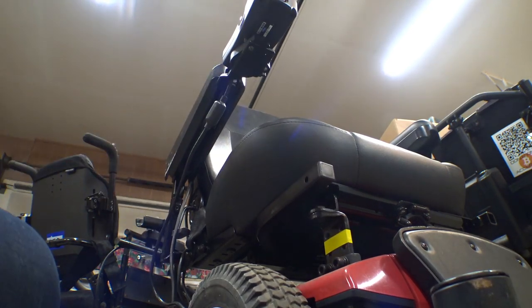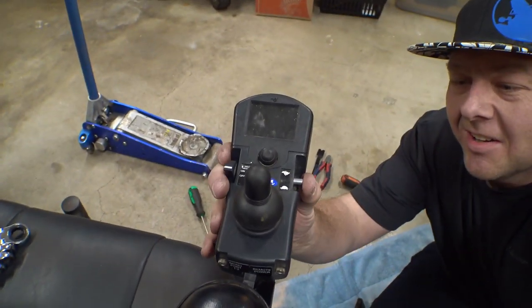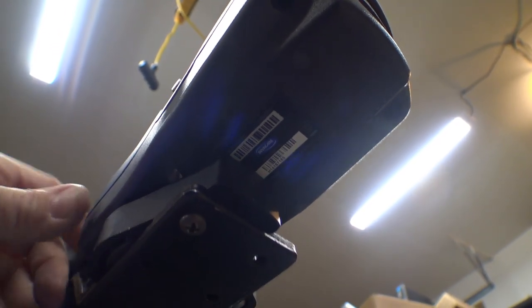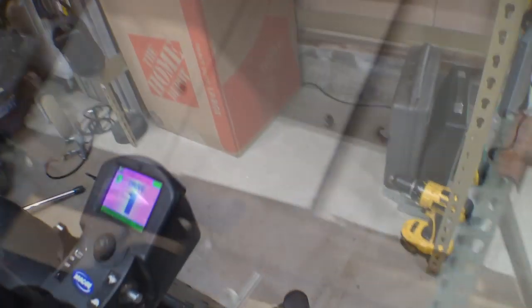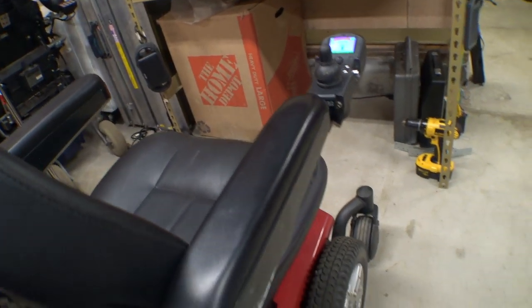We have a joystick and it almost looks like it's supposed to be on the chair. Don't reef on it too hard — it'll move, there's only one screw holding it on. But one screw is better than no screws, and it seems to be pretty solid. This chair wasn't meant to be anyway — this chair is completely unsanctioned by anything considered normal or safe. But what else would you expect? The pink chair apparently lives on and we've got the joystick mounted.